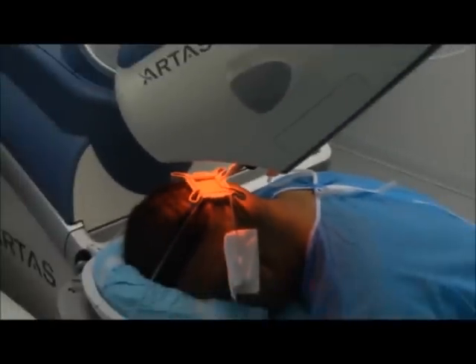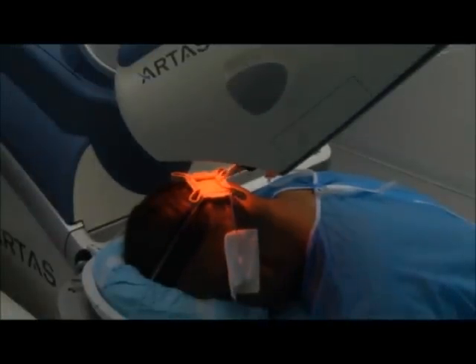For the frontal hairline, we would take the larger follicle units and then divide them up microscopically. In this way, we get the number of grafts we need while minimizing the number of holes.